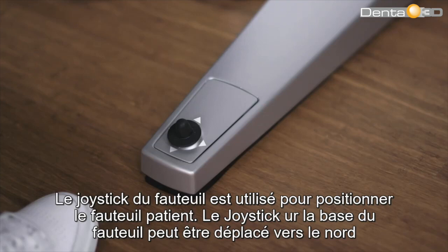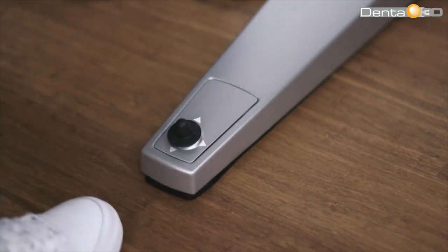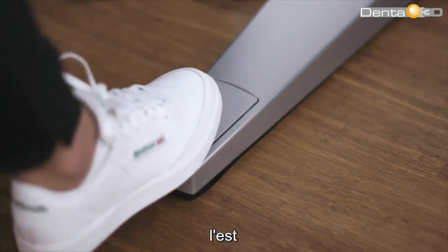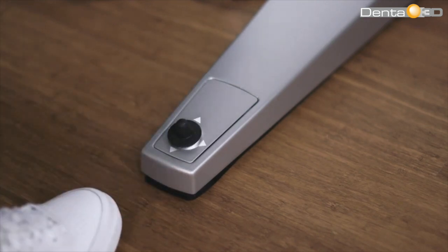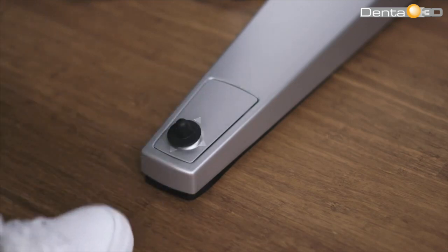The chair-based joystick is used to position the patient's chair. The chair-based joystick can be moved north, east, west, or south.